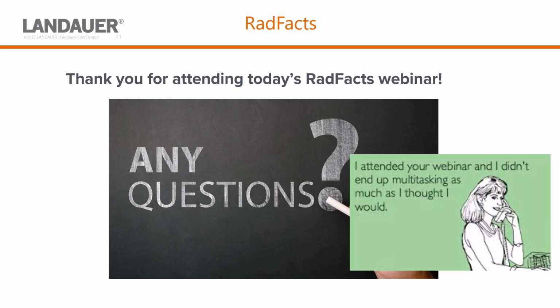Okay. Next question, how do I export data from RadFacts? Okay, I know how, but David, do you want to tackle that one? Kind of the different features like combined PDF and things?